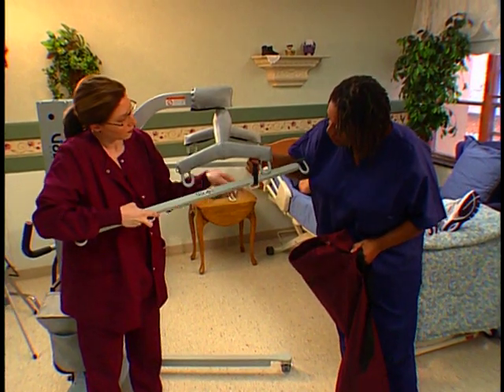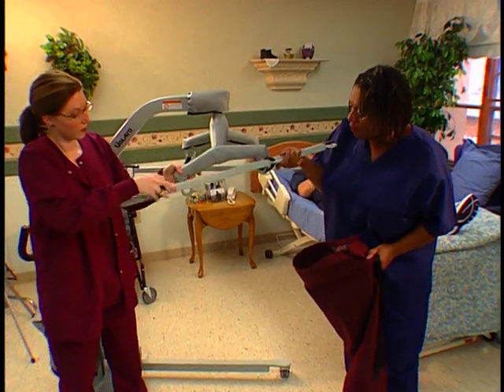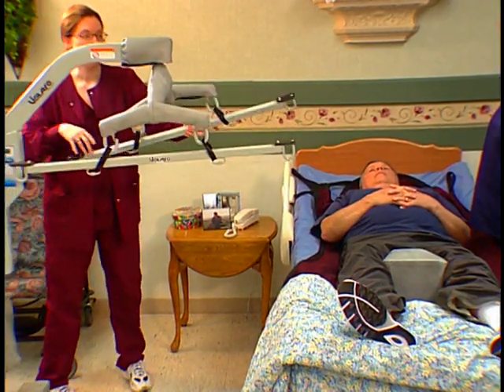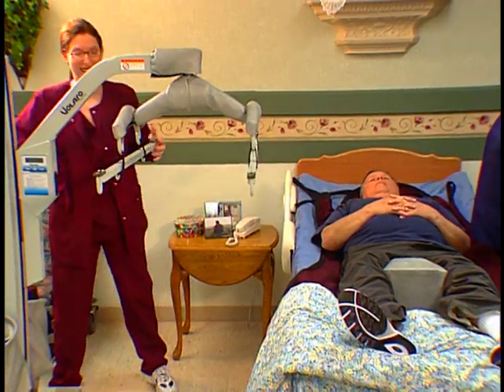Attach R-bars to J-hooks on the lift and double-check connections. Hang the R-bars directly under each moving hanger bar on the lift. The R-bars should mirror the movement of the existing hanger bars. Do not attach the R-bars perpendicular to the hanger bars.